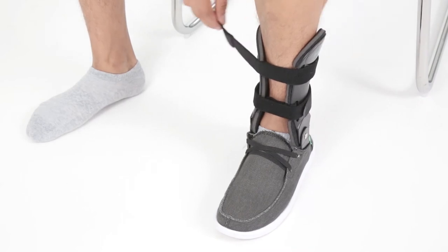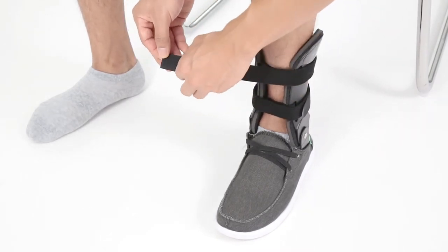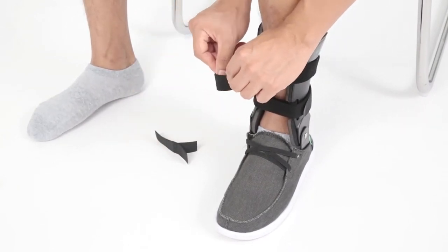If the straps are too long, you may shorten them by removing the end strap connector, folding over the end of the strap, and re-securing the end strap connector.